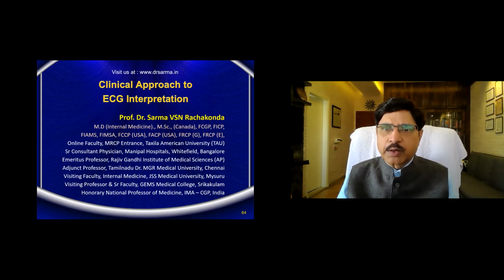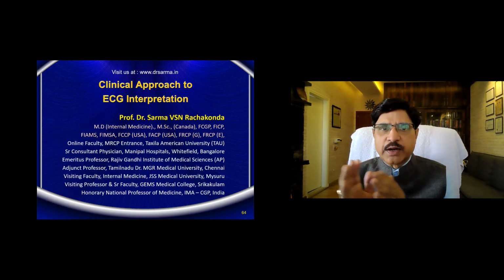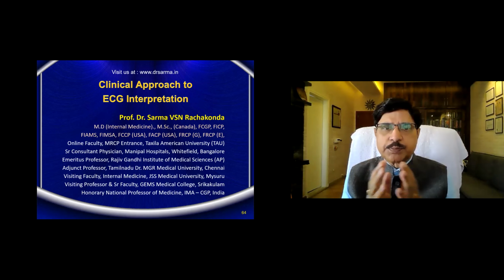Right bundle branch block, left bundle branch block, trifascicular block, and also probably a look at the interatrial and atrioventricular conduction defects, like AV nodal delays, type 1, type 2 and all those things. We will see next week. So that finishes the first part of the ECG workshop. Whatever we have looked at, plus today's lecture and the next one, will be the first part.